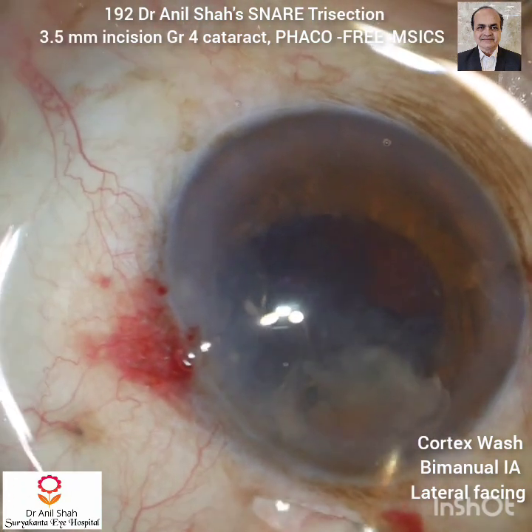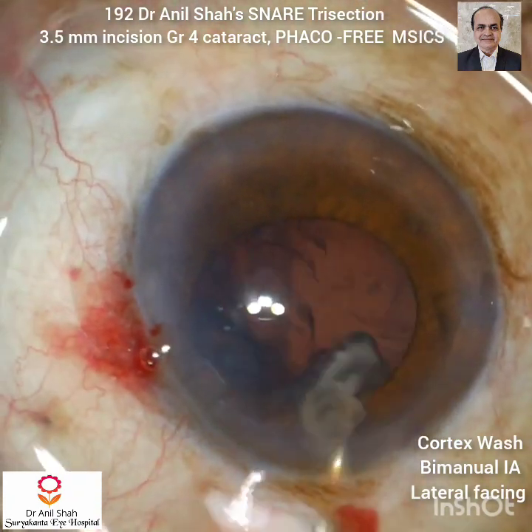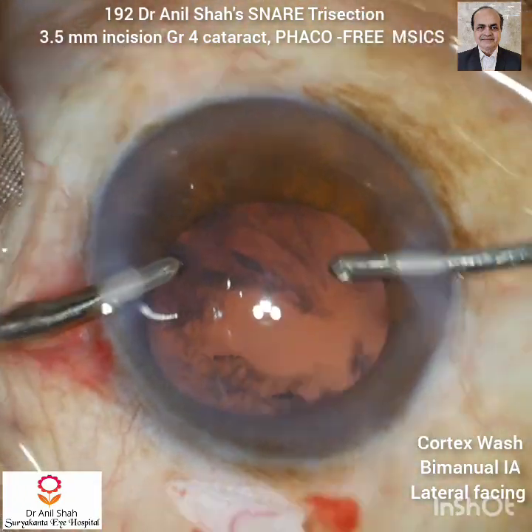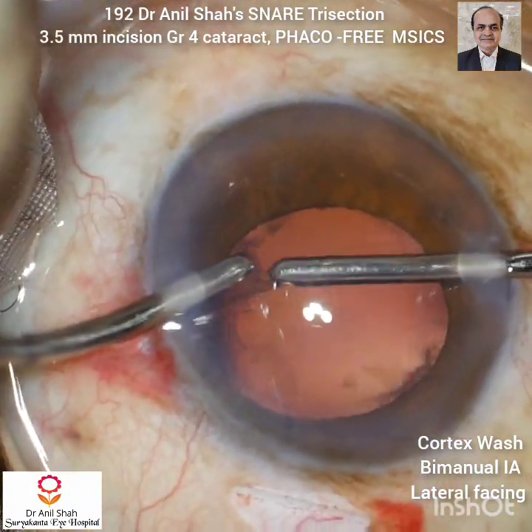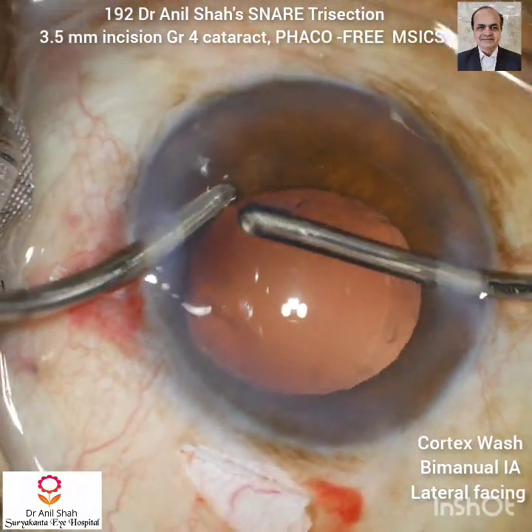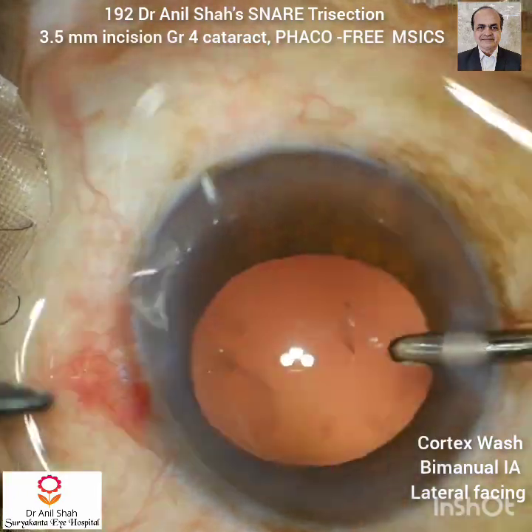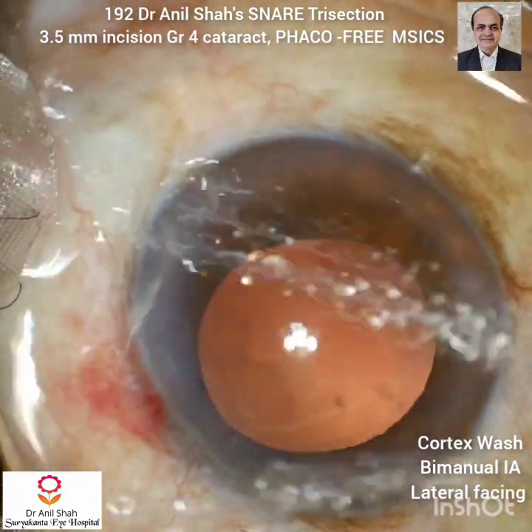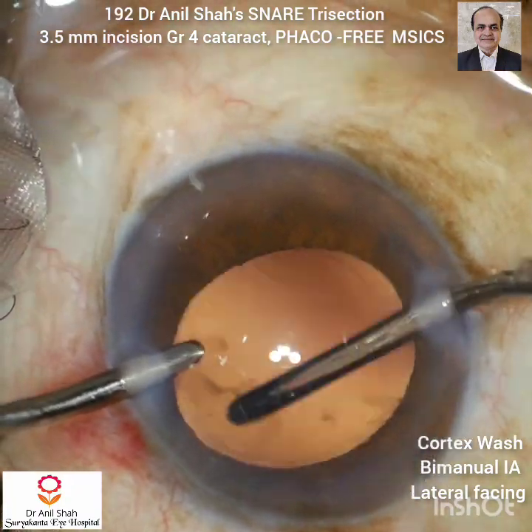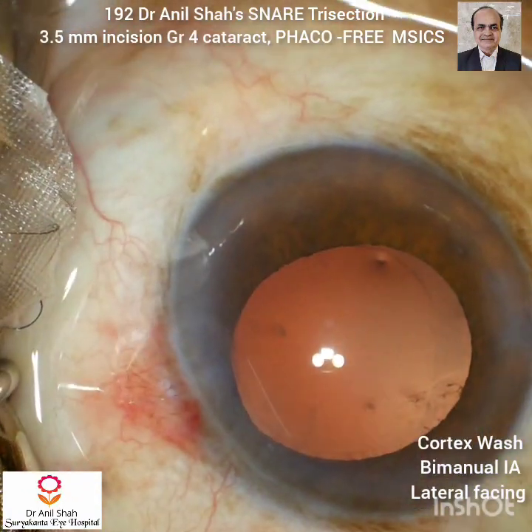Now with the bimanual irrigating cannula I am doing a cortex wash, removing all the cortex and nucleus debris, and also clearing the cortex which is in the angle. Now with the bimanual I will remove the cortex. This is my preferred method of cortical aspiration using a lateral-facing aspiration port which I have designed. You can go deep into the fornices and remove fine fragments of cortex, and this lateral-facing aspiration port is also useful to remove thin cortex lying on the posterior capsule.